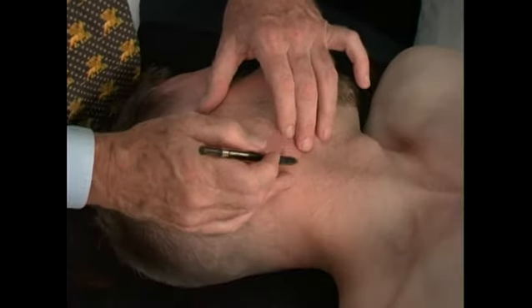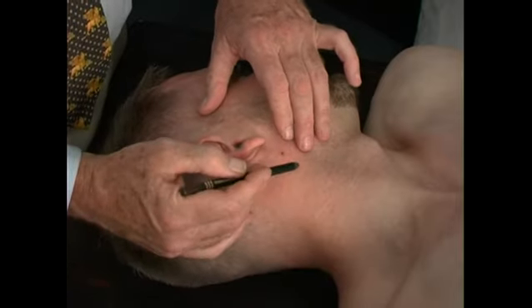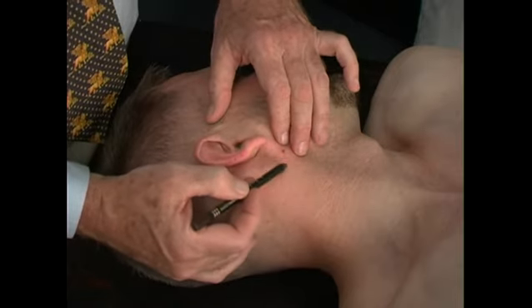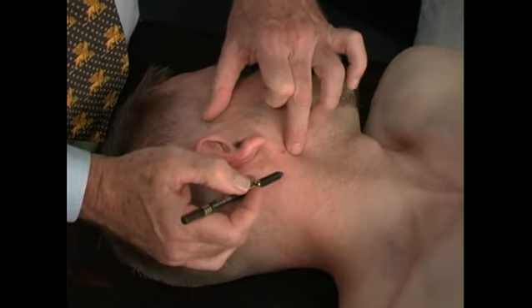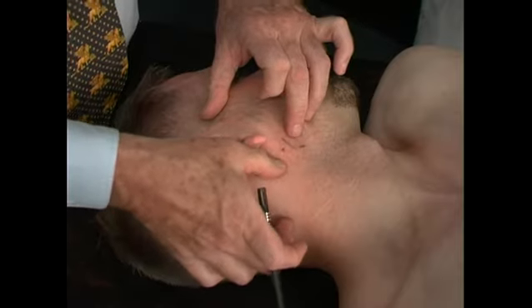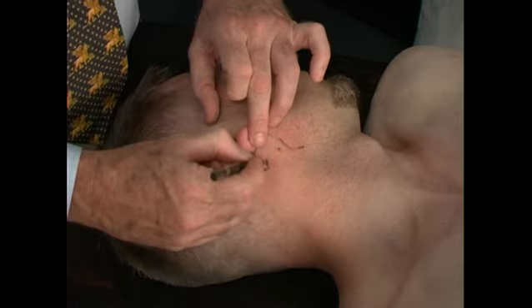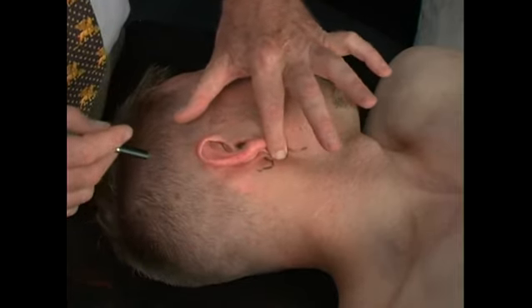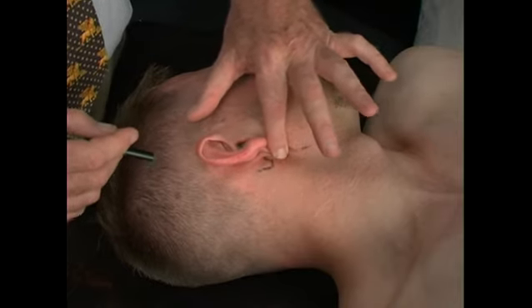We're now going to consider the injections of the tips of the transverse processes in the cervical area. These are bifid, and nerves come out right through them, and of course the vertebral artery runs right in this area as well. We identify the angle of the mandible right here, and the mastoid process, which is right here. And we know that the tip of C1 lies right between the two. It's often tender. People feel tenderness, but in people who have problems there, it's exquisitely tender.